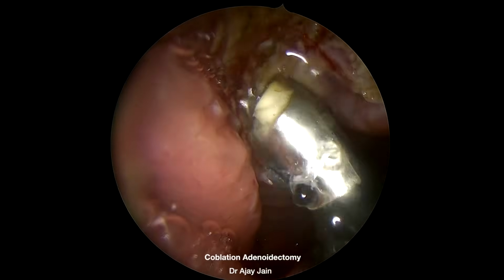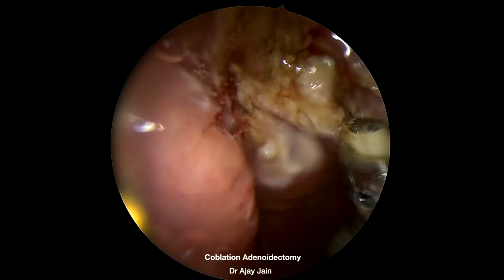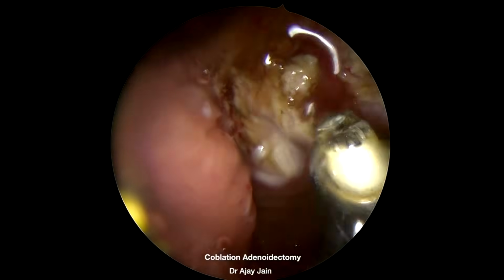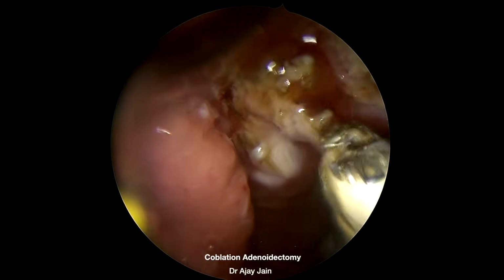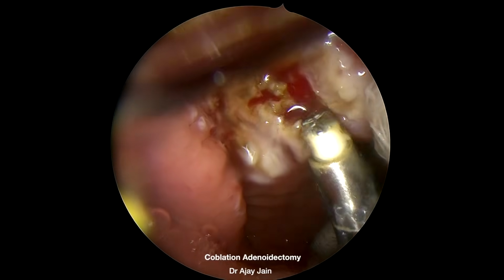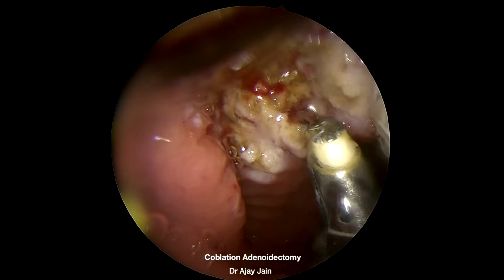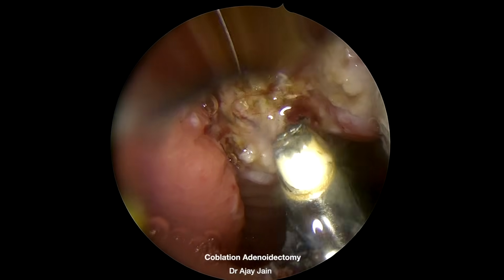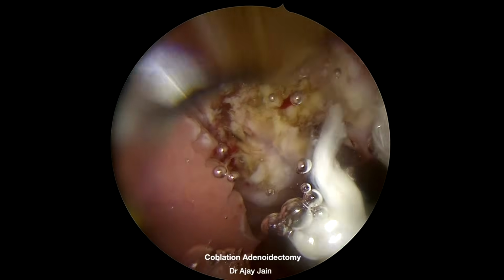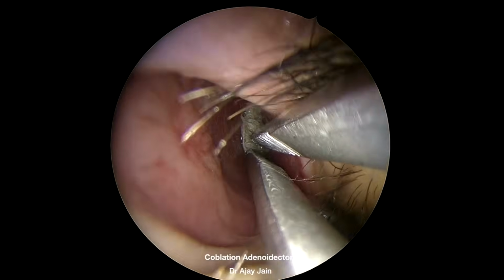Now I have identified the midline on the right side, and this wand requires repeated cleaning. Your nursing staff should not injure the channels, should not use a sharp thing. Best is irrigation, then underwater use the ablator mode to evaporate all the remaining tissue on these channels. Your nursing staff should do this repeatedly so that the wand remains healthy till the last. Otherwise, I have seen blocking of the wand even 5 to 10 minutes after surgery.